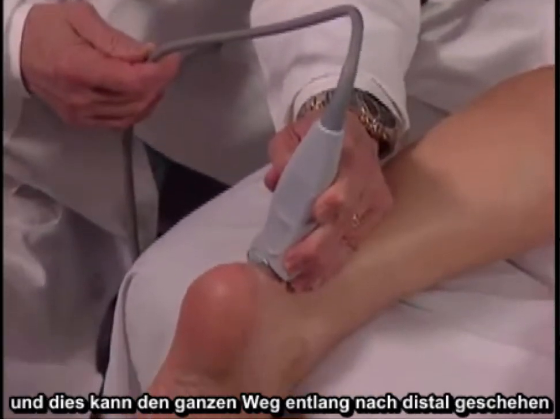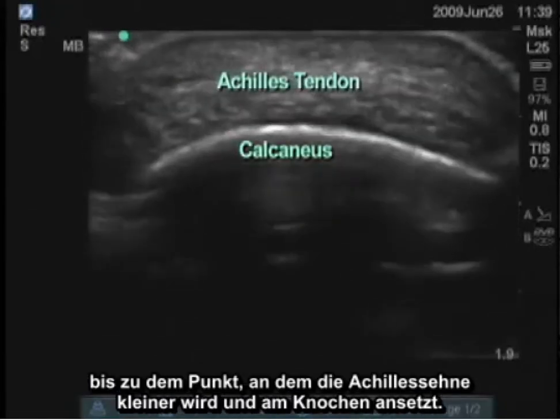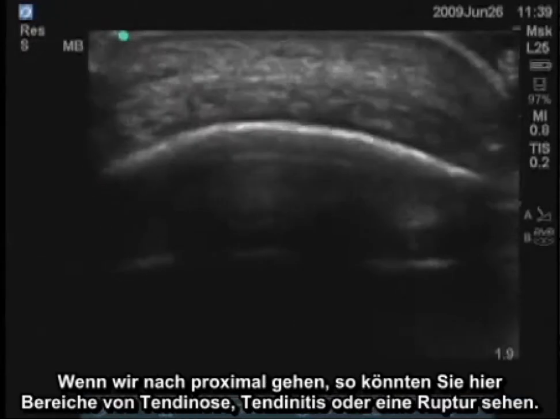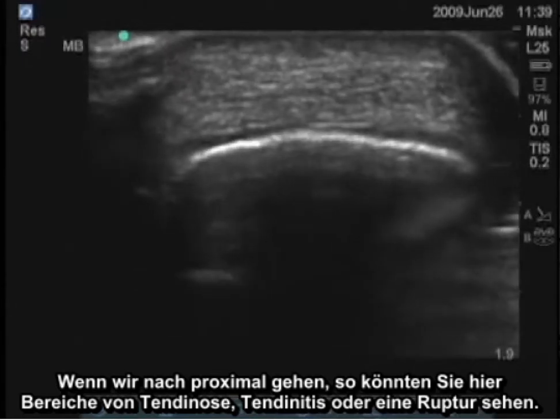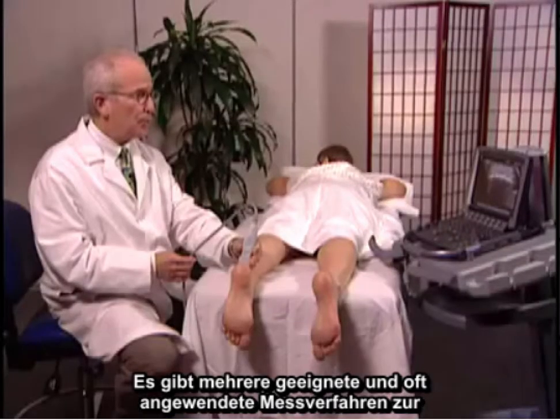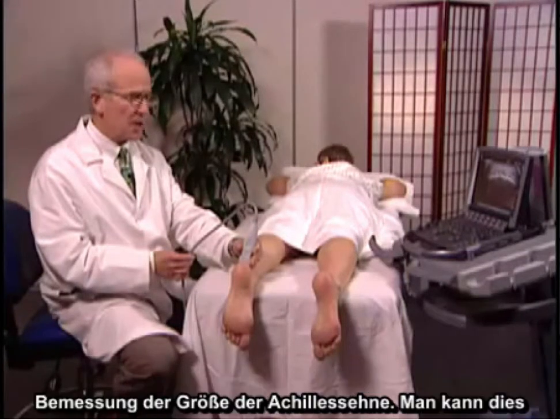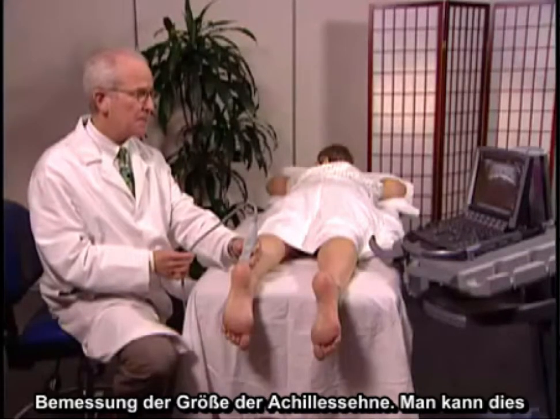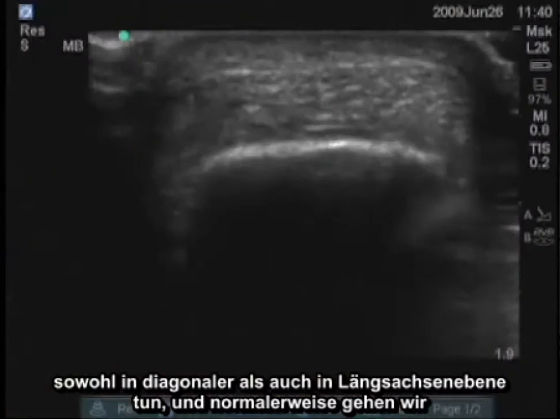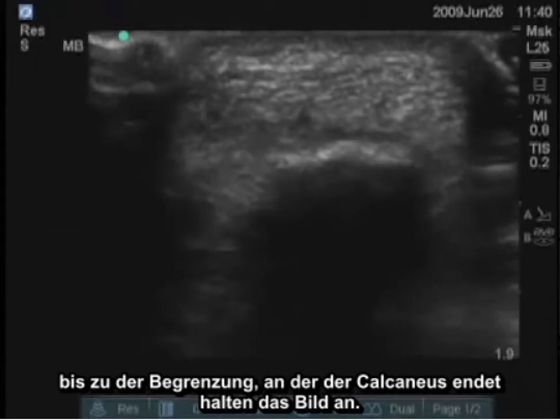We should also examine the Achilles tendon transversely. This can be done all the way distally to the point where the tendon gets smaller and inserts on the bone, or moving proximally you might see areas of tendinosis, tendinitis, or rupture. There are a number of appropriate measurements frequently taken to assess the size of the Achilles tendon, which can be done in both the transverse and longitudinal plane. Usually we go just to the border where the calcaneus ends and freeze the image.